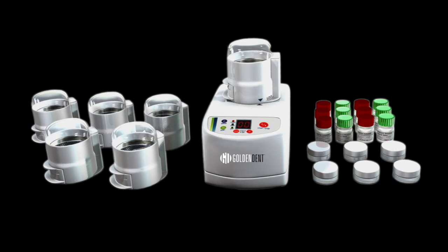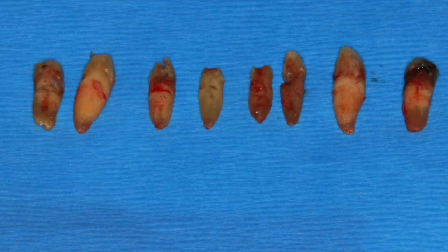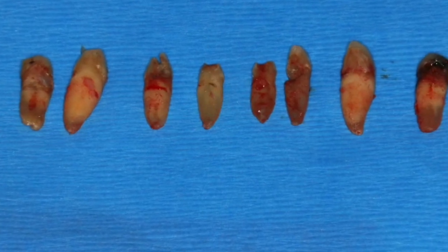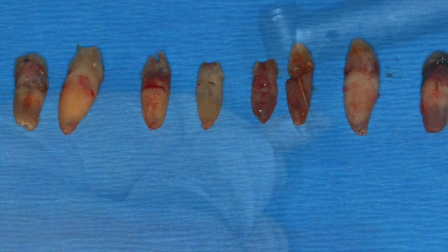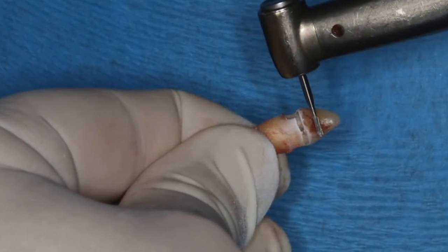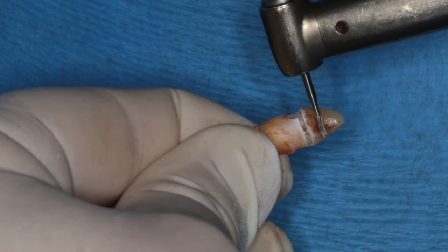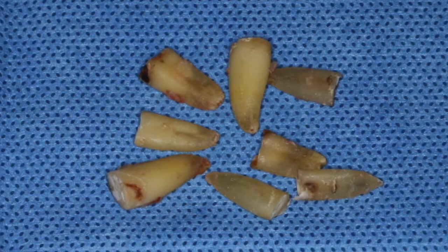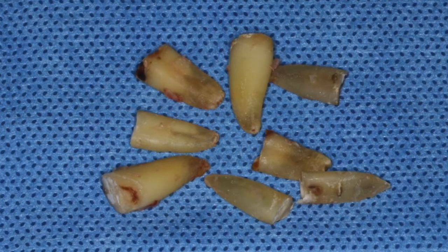Once the teeth are extracted, the teeth will be prepared using the Golden Dent Grinder. The coronal portion of the teeth — in my situation — I will remove with a burr because I don't want to use any teeth that have restorations or fillings, and root canal treated teeth should not be used. Here are the teeth that we extracted, and I'm simply taking a burr and removing the coronal portion. You can use enamel — that's not a problem, it'll just take longer to resorb.